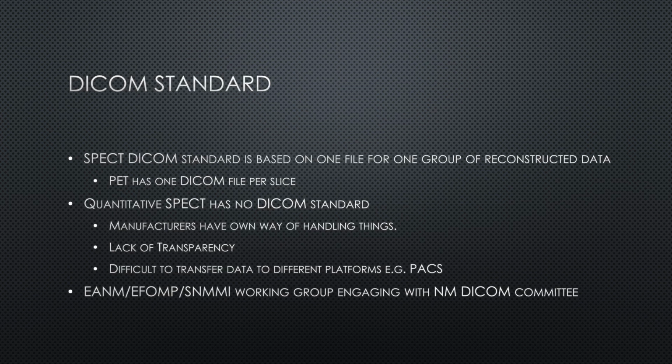Finally, a limitation of quantitative SPECT is that there is no SPECT DICOM standard for quantitative SPECT. Also, there's some kind of divergence where if you have a SPECT brain, for example, you get one image file, where if you did a PET brain, you would have a file for every slice. So quantitative SPECT has no DICOM standard, and manufacturers have their own way of handling things. There's a lack of transparency.